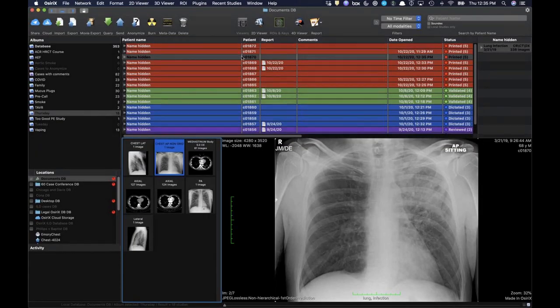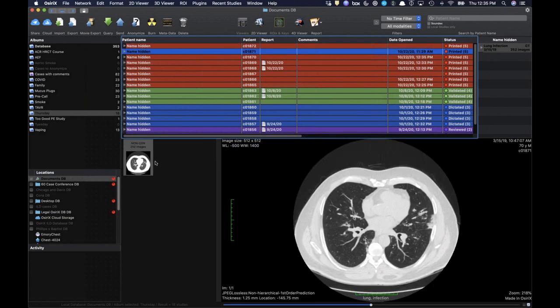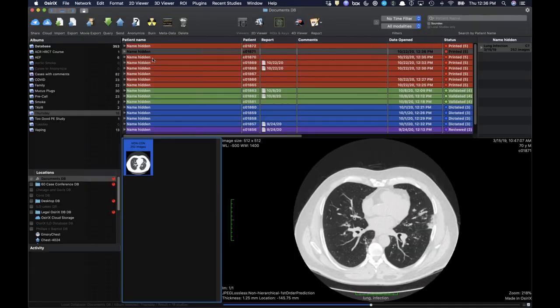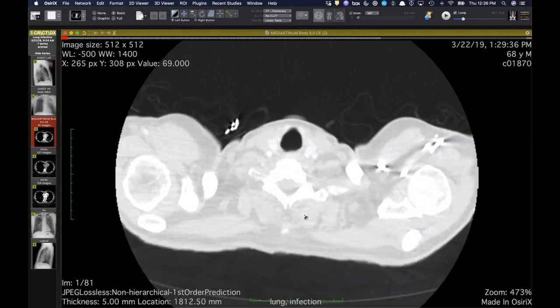And Travis, if I'd seen that here, I would have said that looked like blastomycosis. But histo usually, when we see it active, is usually a nodule or nodules, with disproportionate lymphadenopathy on that side, and consolidation is really uncommon for histo, right? Yeah, but for blasto, I could pass that case off as blasto.